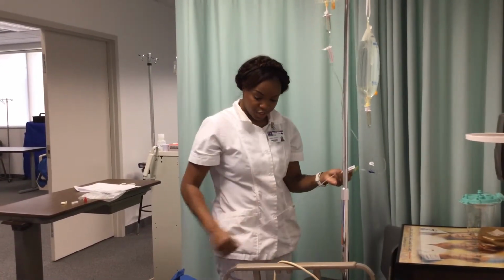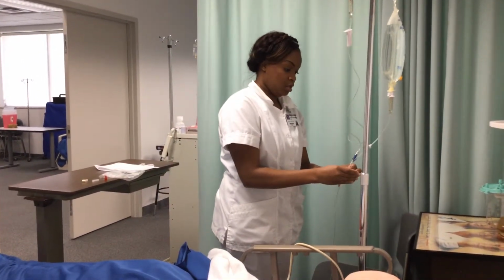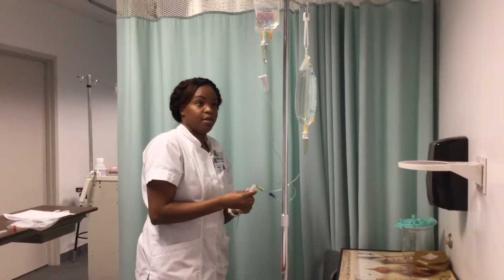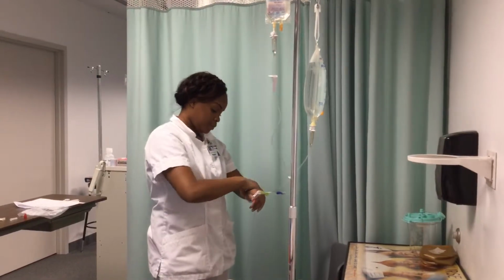So I'm going to go ahead and try to set this. Make sure this is open. Go ahead and set this.